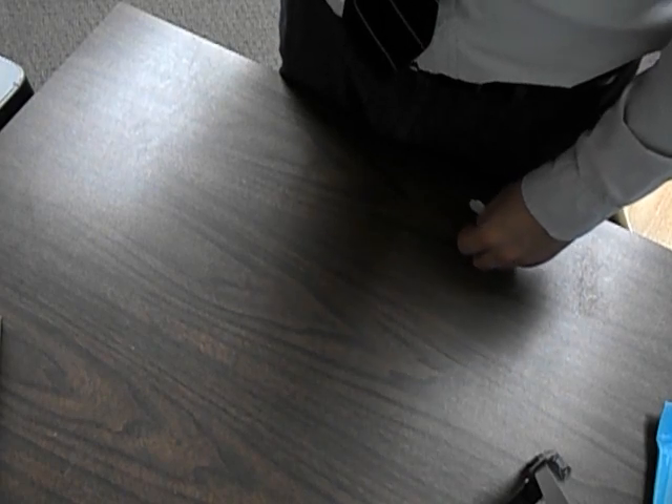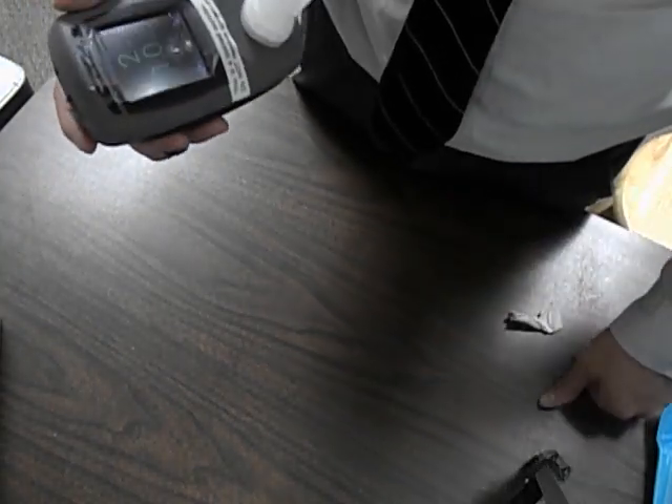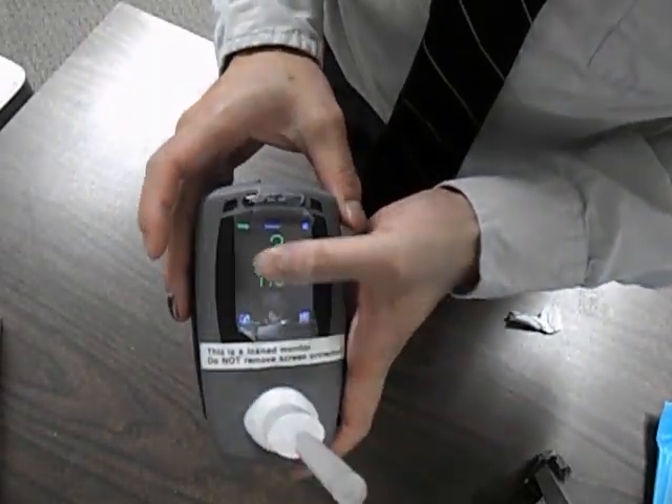As for how long they should breathe out — just one expiration period. Make sure they don't take two or three breaths when they breathe out; just tell them to breathe out as long as they can. It doesn't have to be 15 seconds long — about a good five to six seconds will be adequate.